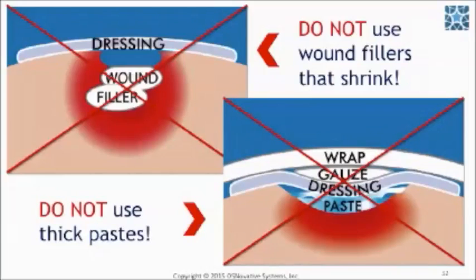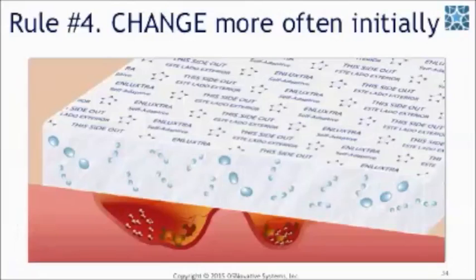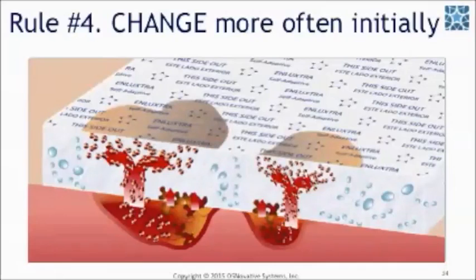This will cause wound maceration. Rule 3. Always change Enluxtra before the exudate reaches the dressing edge. Rule 4. Change more often initially. Enluxtra is designed to stay on a wound for up to 7 to 10 days.